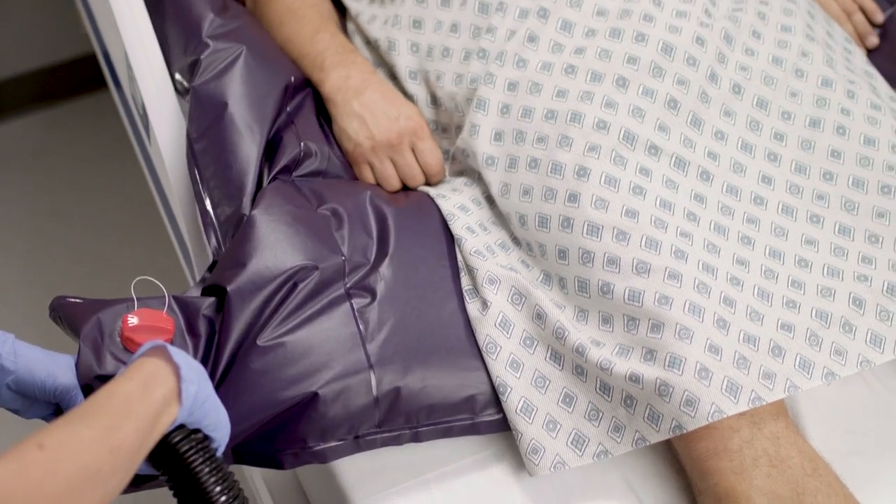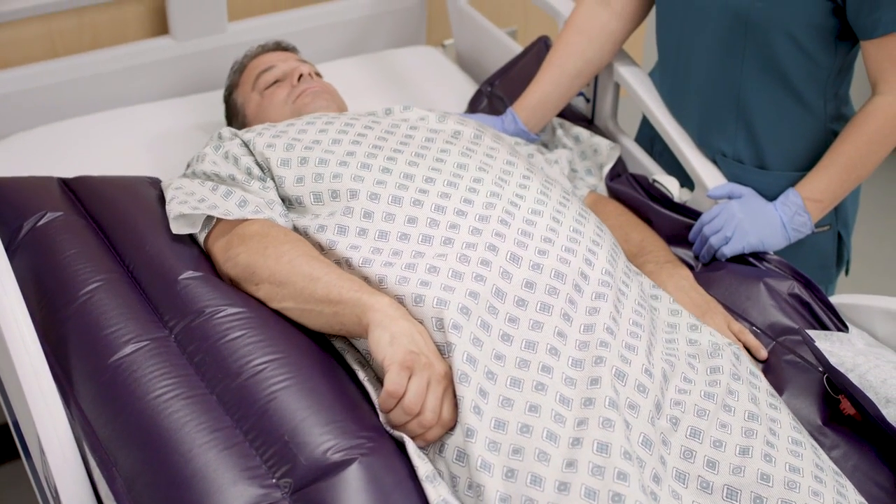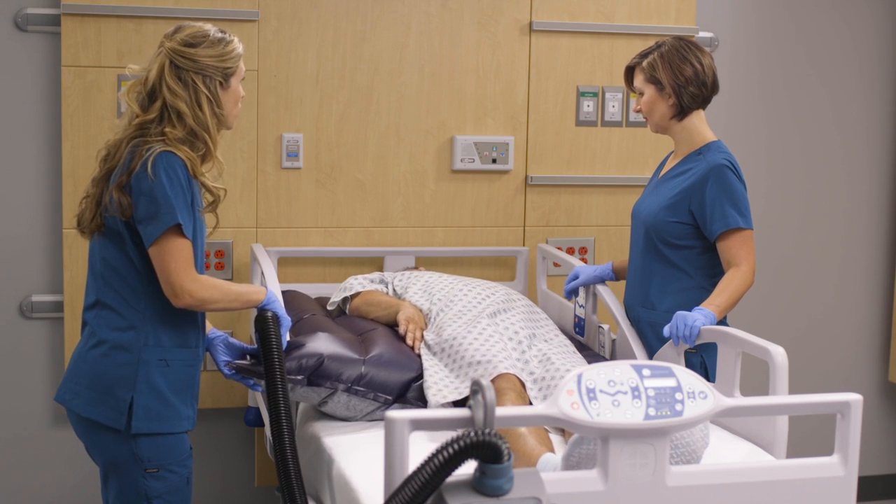Slower inflation may benefit patients with significant pain or patients who are frightened. Note that the chamber may not need to be fully inflated to achieve the desired patient positioning.